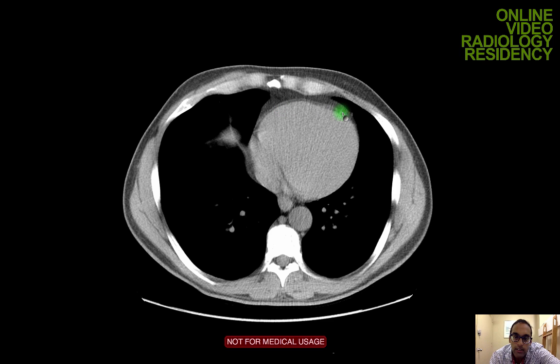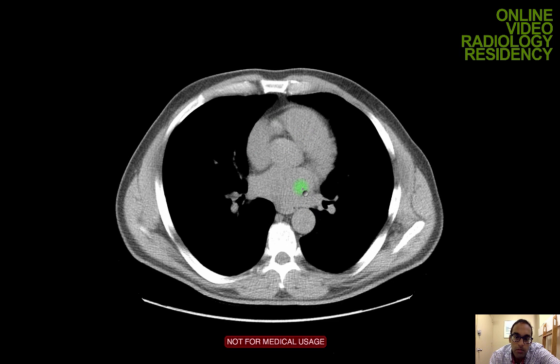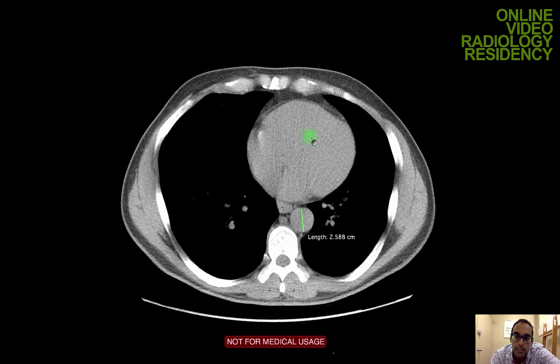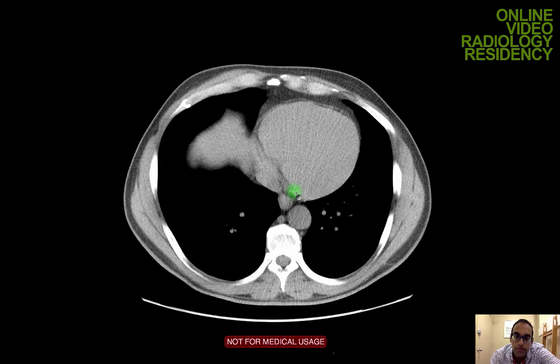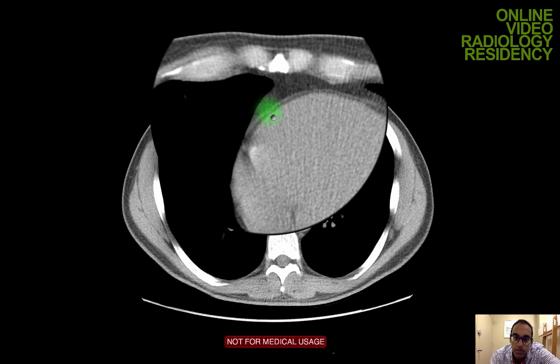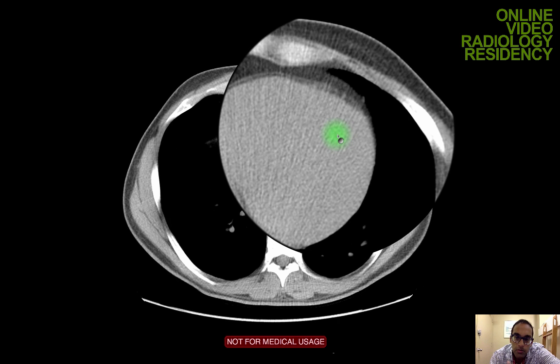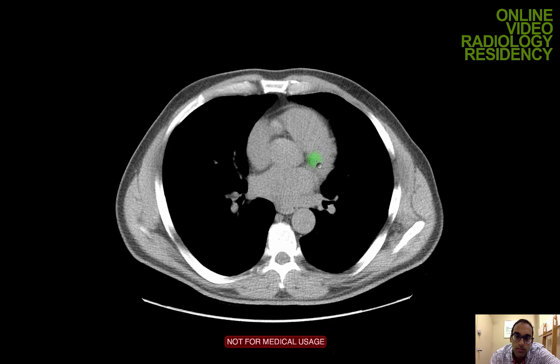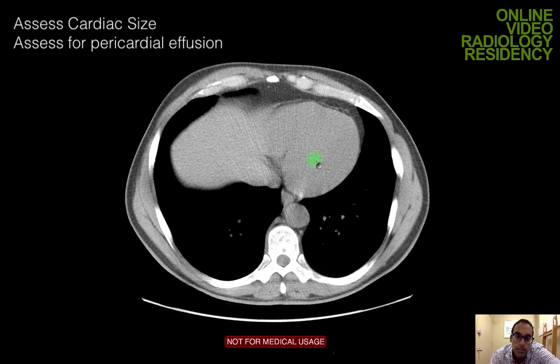The heart is not well evaluated on non-contrast chest CT due to motion and lack of contrast, so I can't differentiate myocardium from the endoluminal blood-containing portion. However, I can assess overall heart size and look for pericardial effusion. There's a small amount of fluid here around the heart. If there's a large amount or an increase from a prior study, I comment on the effusion, as it can be clinically relevant.